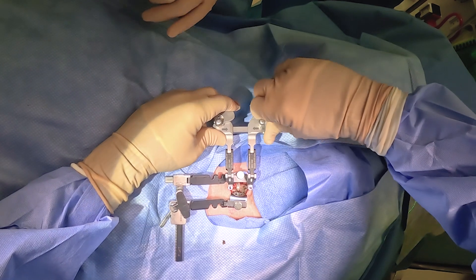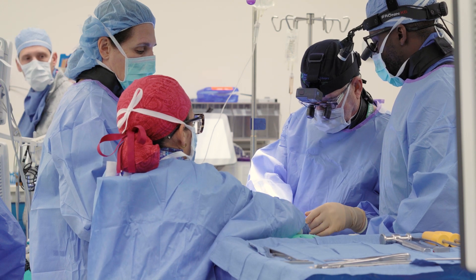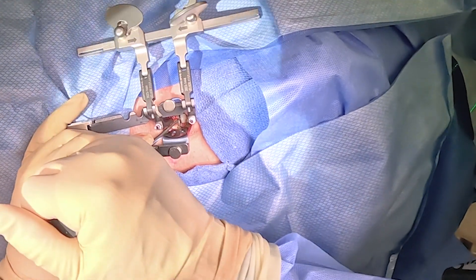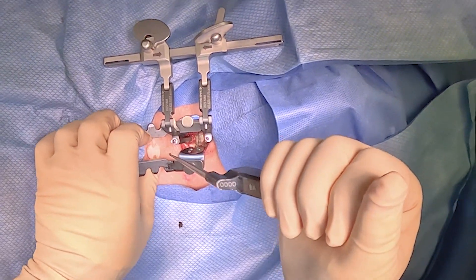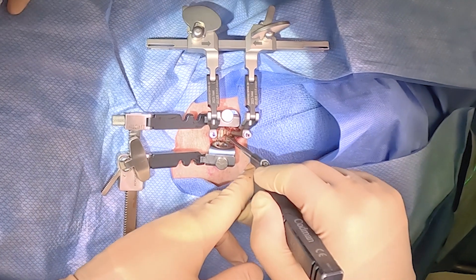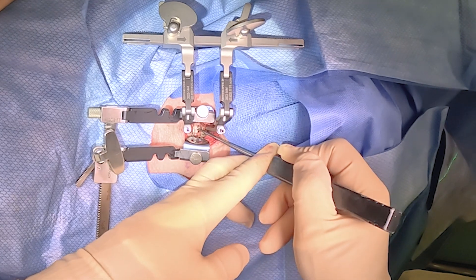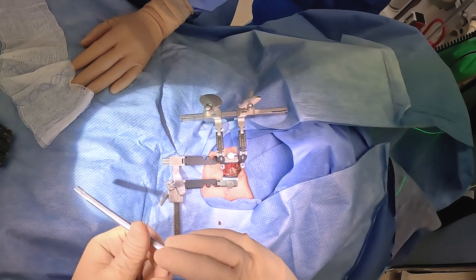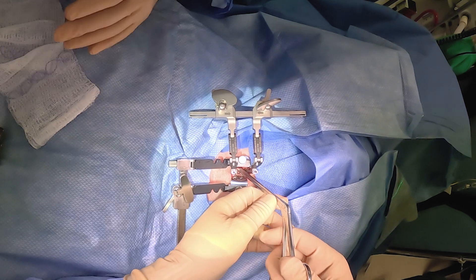Here we go with the first maneuver to remove the disc safely and easily, and that's to distract the pins. What this will allow us to do is first to take the core out — this is the plastic or polyethylene core, and this would be removed first. Now we've got the two end plates, and the two end plates can be removed with a thin osteotome that just goes underneath the end plate so as not to damage the vertebral end plate, which you need to preserve to be able to do a revision disc replacement.